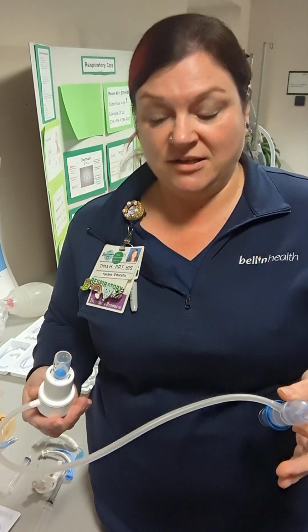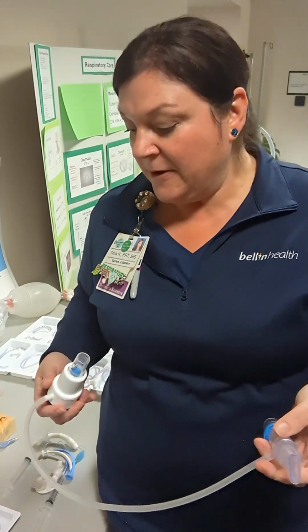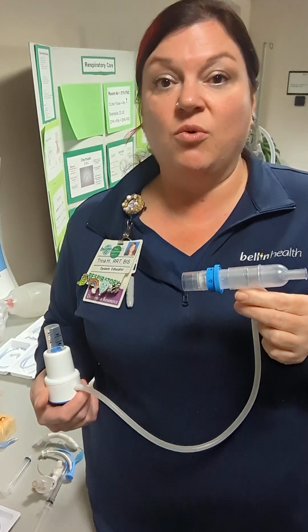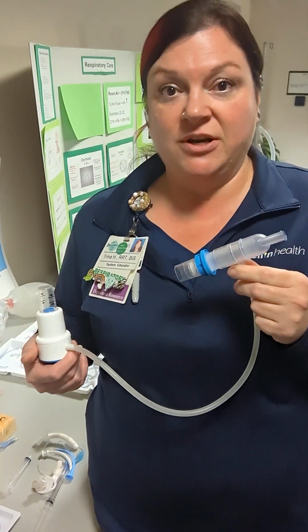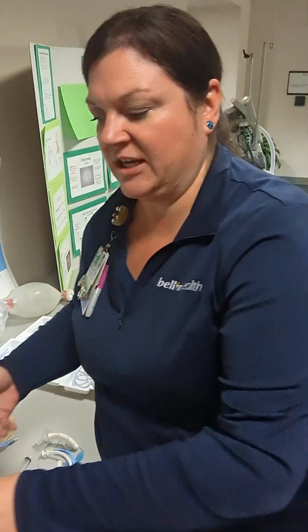And a prolonged exhalatory phase will do the same thing as a prolonged inspiratory phase. It does require an order, so either you may ask the doctor or you can have RT get that order from the doctor, but this is a great alternative to IS, and in addition, for any kind of lung expansion we need to do.